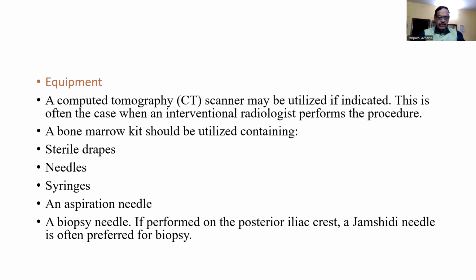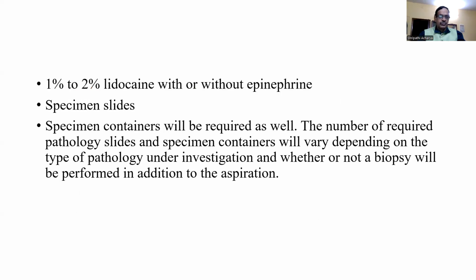If performed in the posterior iliac crest, a Jamshidi needle is often preferred for biopsy. 1 to 2% lidocaine with or without epinephrine, and specimen slides and specimen containers will be required as well. The number of required pathology slides and specimen containers will vary depending on the type of pathology under investigation and whether or not a biopsy will be performed in addition to the aspiration.